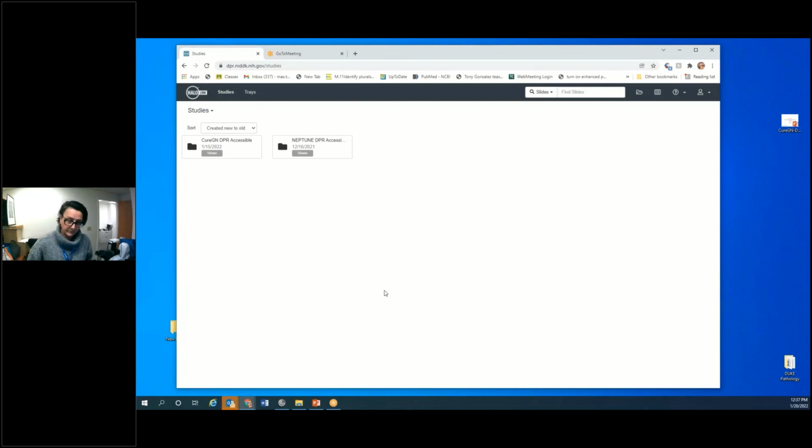essentially makes the markup image or the annotations useless. So the viewer role within the software doesn't allow for rotation currently. That's set there so that if there is analysis or there are annotations, they can't inadvertently be changed. Typically someone coming into the system as a viewer on a study may not have the background or knowledge that rotating will cause those issues. And so we have a limited permission there.